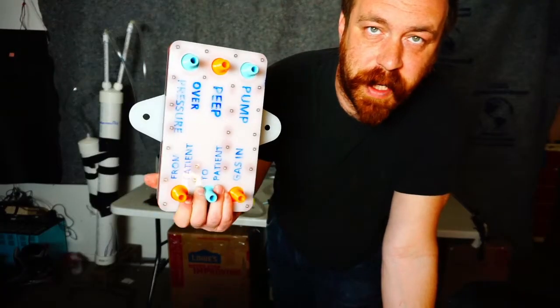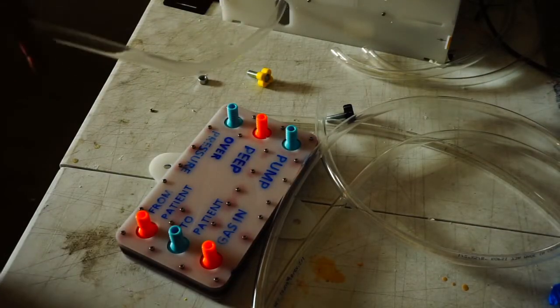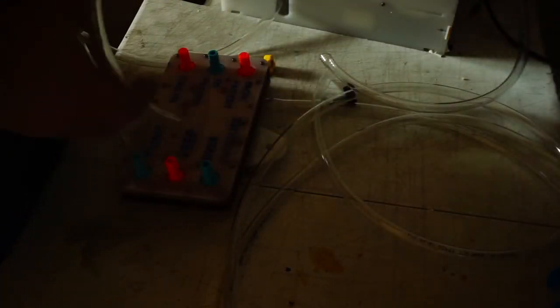Okay, so now that we've assembled the valve block, let's hook it to the machine. Alright, so the connections are fairly simple. This guy comes from the pump over here. So that goes to pump. This goes to the PEEP. This goes to the overpressure. This guy is from patient. And this guy is to patient.